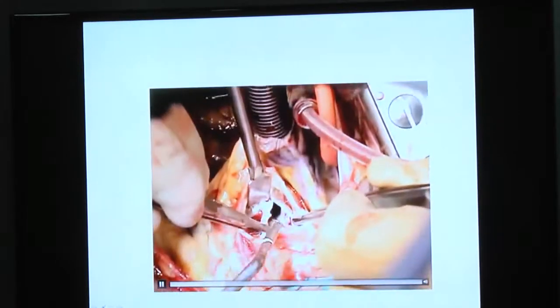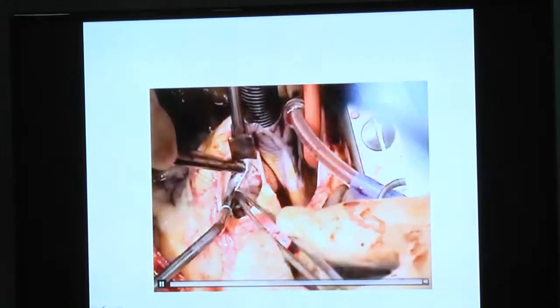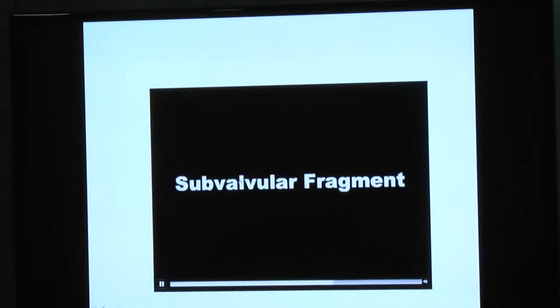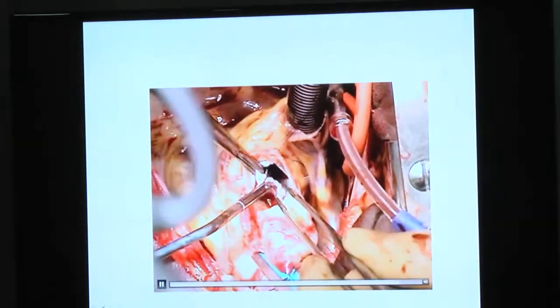If you can see, the surgeon is handling this, the right coronary cusp, and here, when you see, the left coronary cusp is pushing the probe, it is going into the fenestration in the non-coronary cusp, you can make out. And also, in fact, one of the small fragments of the cusp has been torn. You can see the oscillating fragment there in the region of the left coronary cusp. That was the reason for the AR, you can make out.